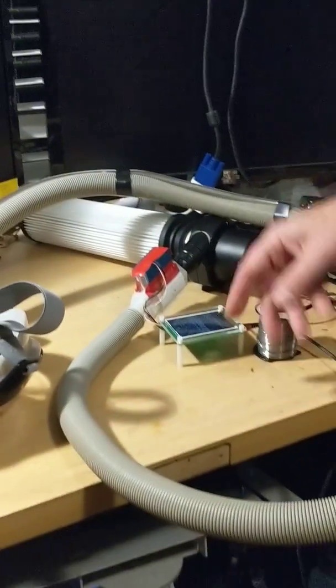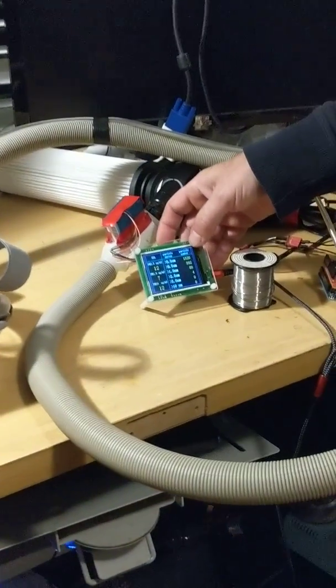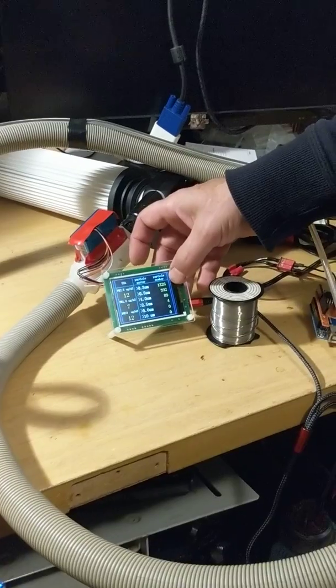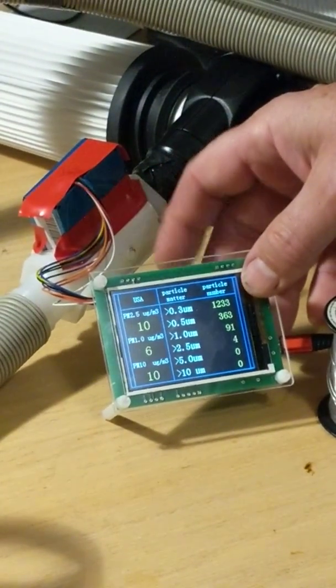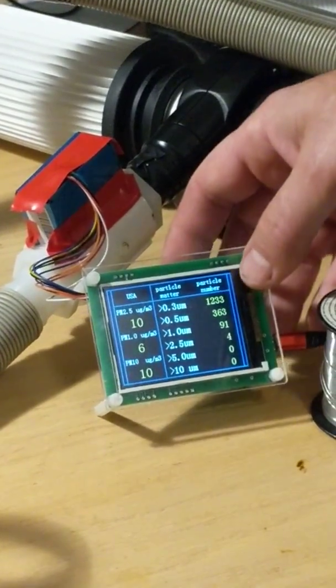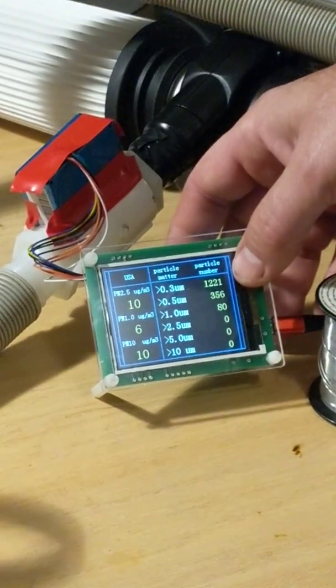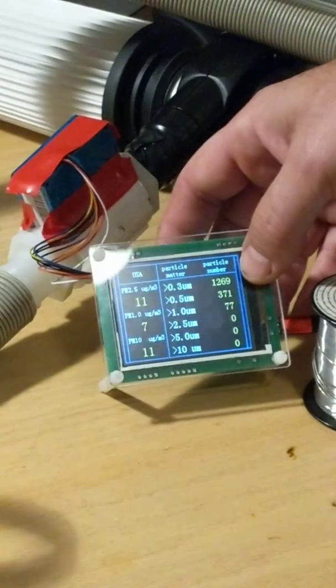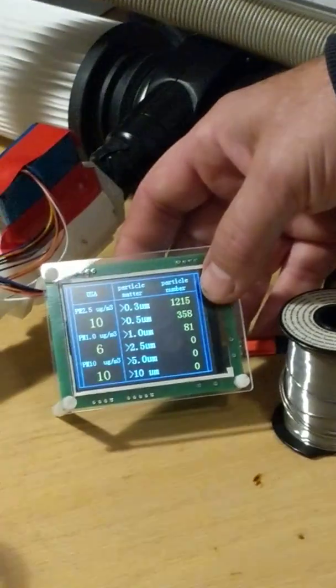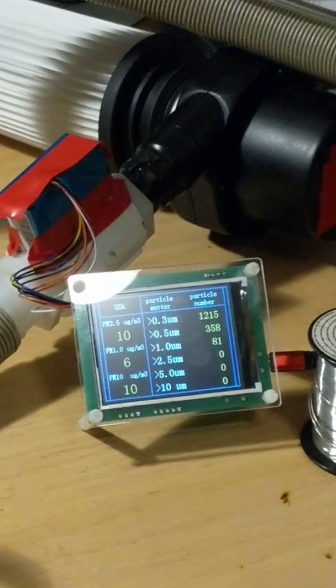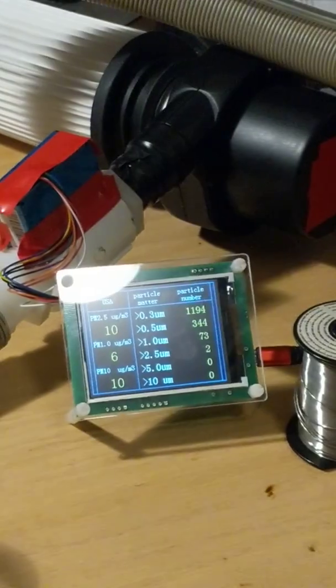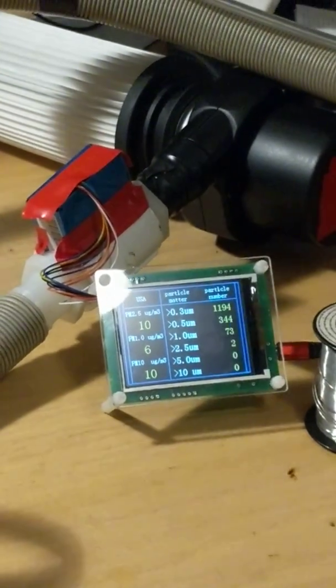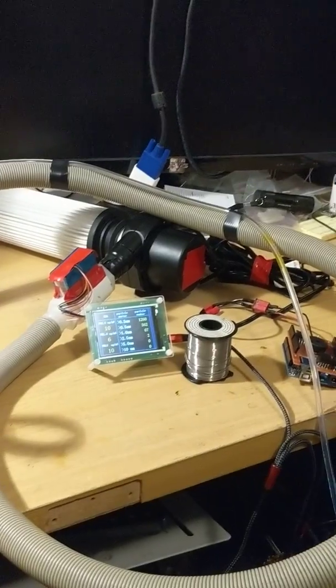Now, I have here an air quality indicator, which is counting particulate matter in the exhaust from the filter. And right now, the filter's not running, so you see the ambient air quality in the room is about 1,200 particles of 0.3 micron size. That's pretty typical for ambient quality.